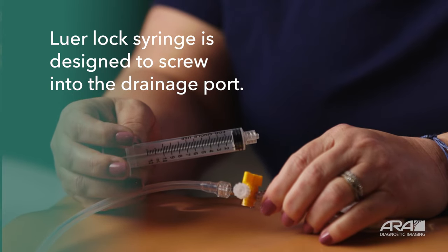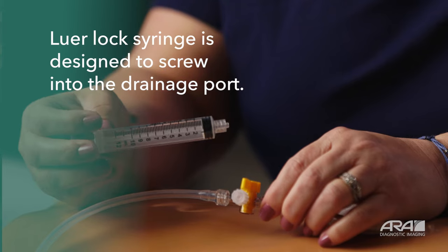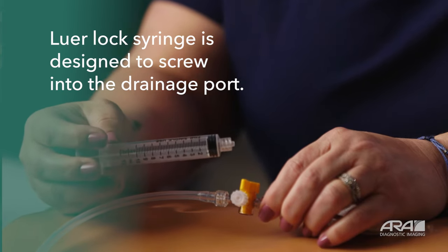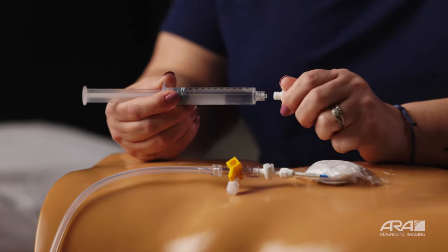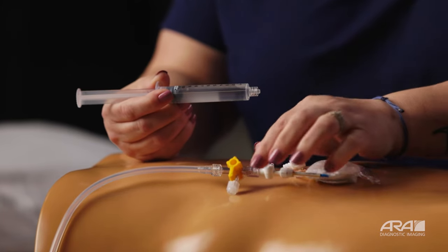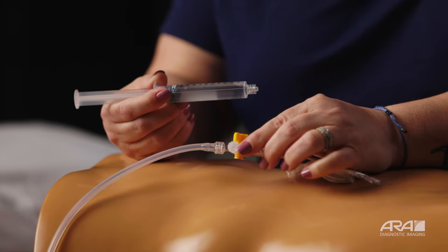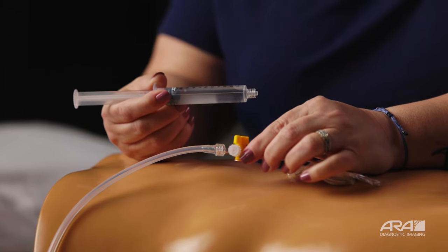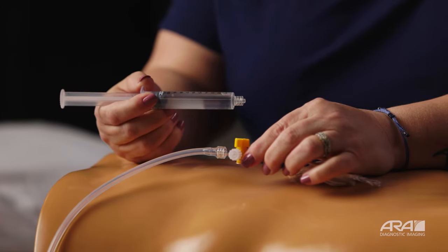You will not need to twist this tightly — just twist until it is firmly in place. This saline syringe is what you'll use for flushing your catheter tubing. This syringe is also a luer lock, so it will screw into your connecting port. Again, you don't have to screw this in tightly — just screw until it is attached firmly.